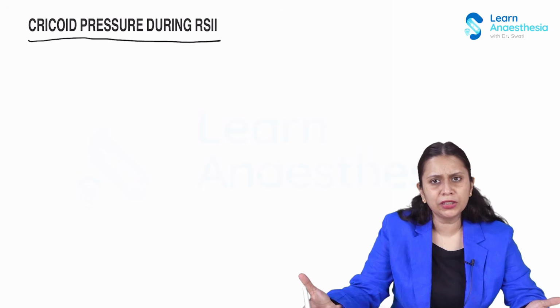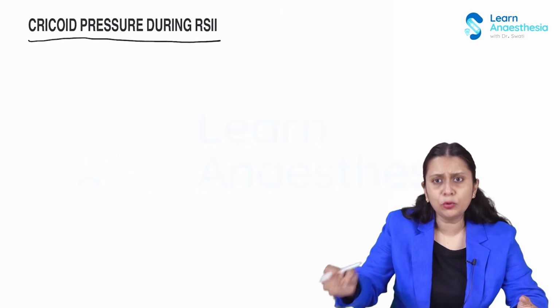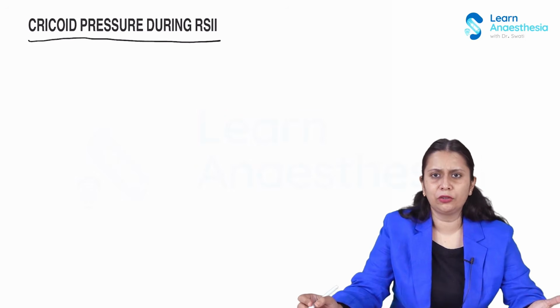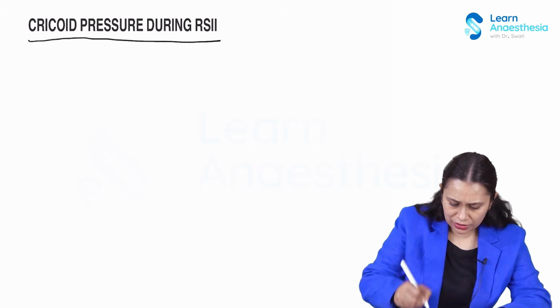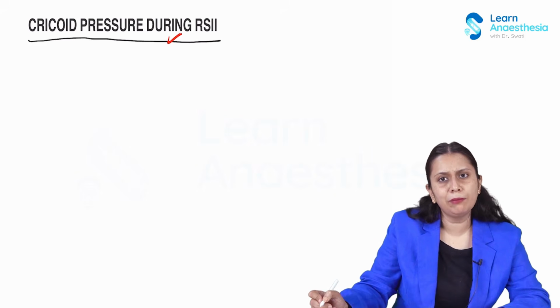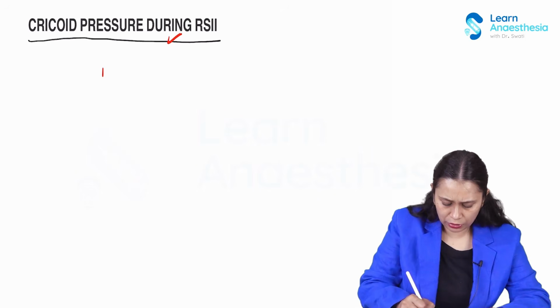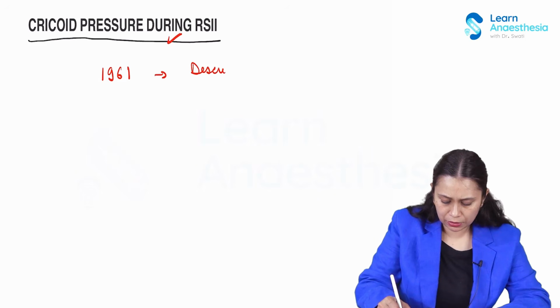Studies have shown that applying cricoid pressure has given no harm, though it can make the airway difficult. So if I'm not able to intubate, then we release the cricoid pressure. But otherwise, we practice the use of cricoid pressure. Okay. So what is this cricoid pressure? This is applied during RSI. It was first described by Sellick in 1961. So it is also called Sellick's maneuver.